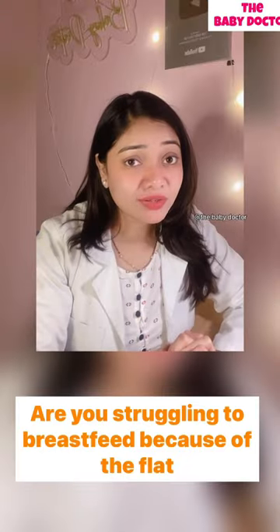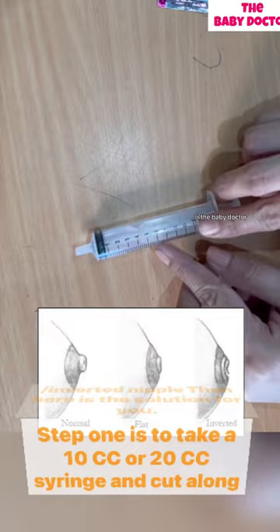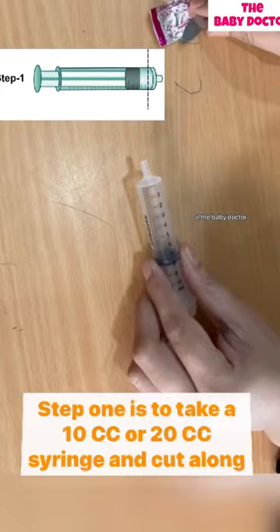Are you struggling to breastfeed because of a flat nipple? Here is the solution for you. Step 1: take a 10cc or 20cc syringe and cut along one side with the help of a blade.